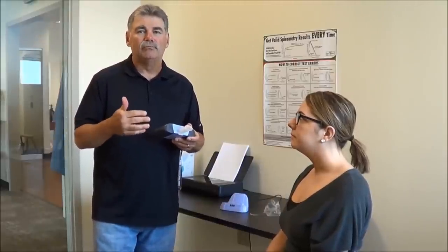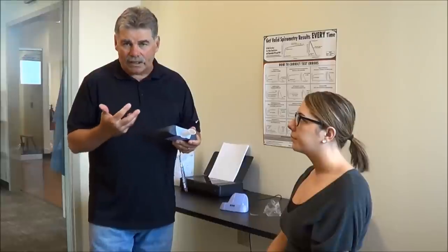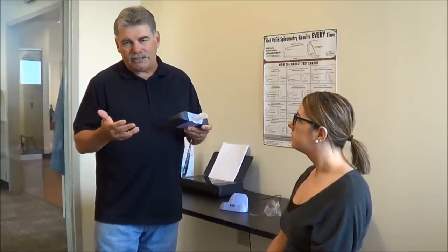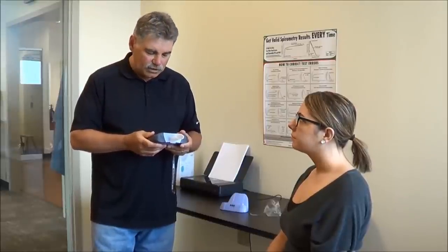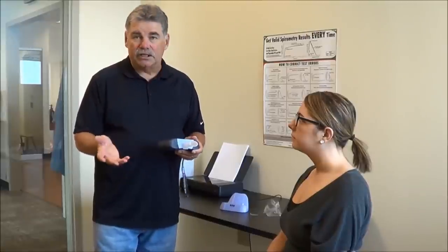It could take you more. And usually what happens is those first couple of trials, maybe the patient is still figuring out how to do this, or you're figuring out how to coach and get them to do the things correctly. So ATS says go up to 8 trials. We were fortunate to get that done within 3 trials. So at this point for my pre-med spirometry, we're actually done.